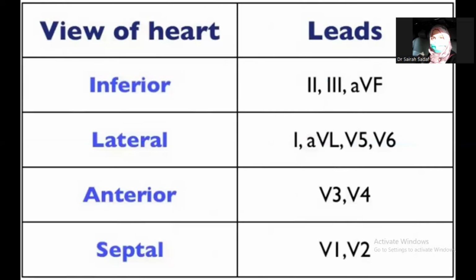Now, each lead represents a different side of the heart. So it's not like echocardiography, it's electrocardiography. Each lead represents a different side of the heart, meaning the electrical activity going on in a different side of the heart, right? Just a second, please. You can take the screenshot of this.